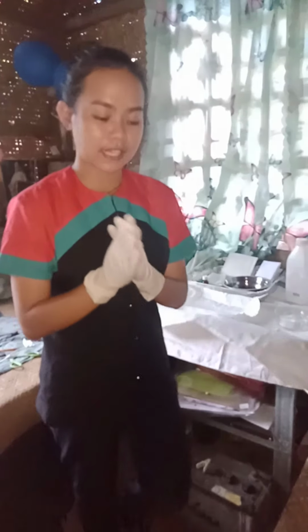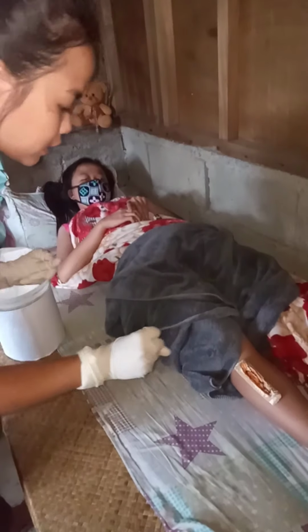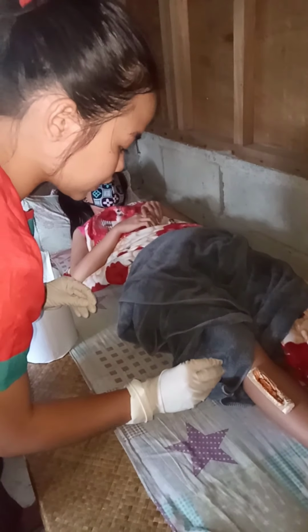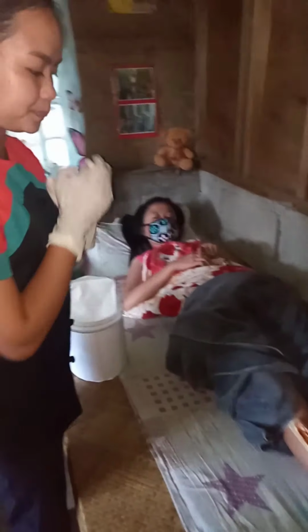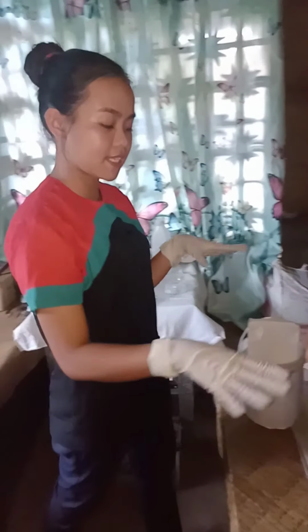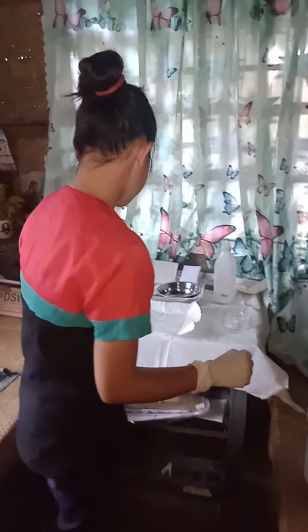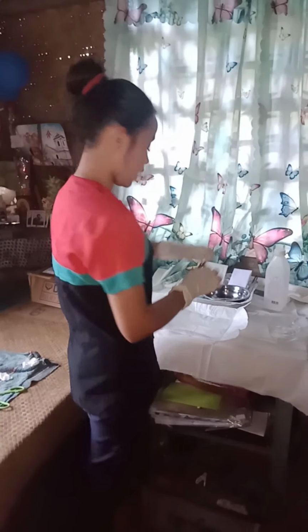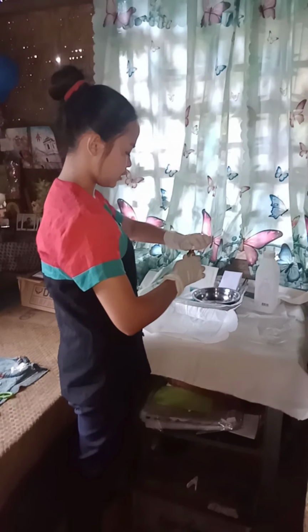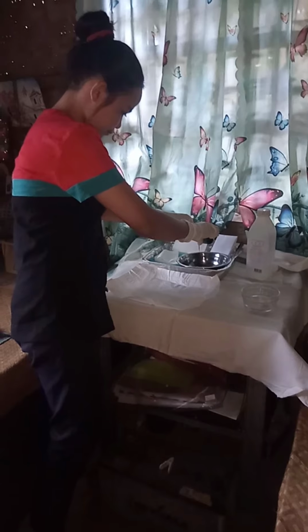Then after that, inspect for color of the wound, character of the drainage, type of suture, and the appearance of the wound as well. Then next, it is the time to cleanse our wound with this prescribed antiseptic solution. Then pour it into the sterile basin.